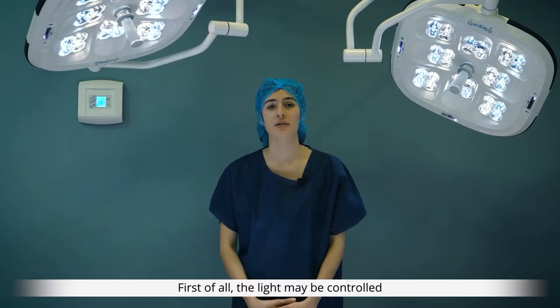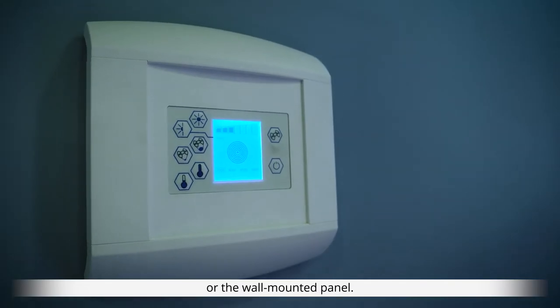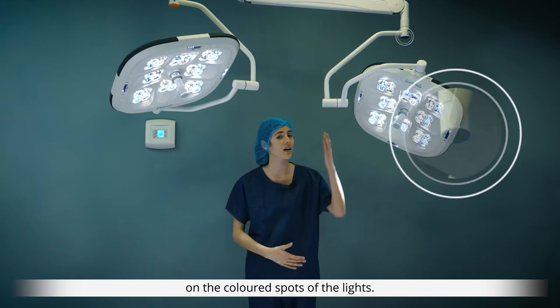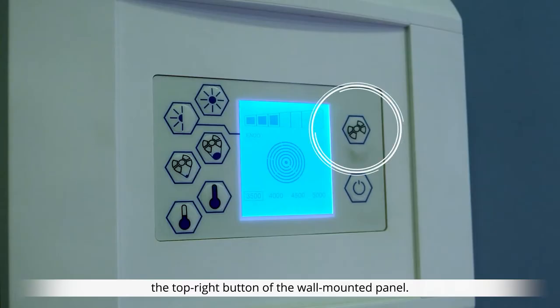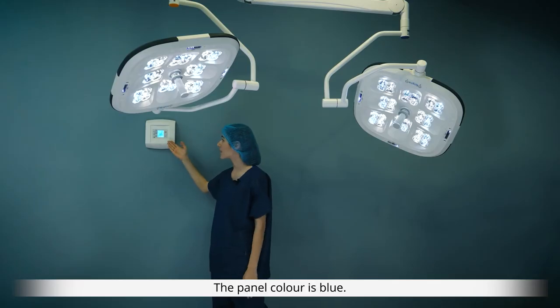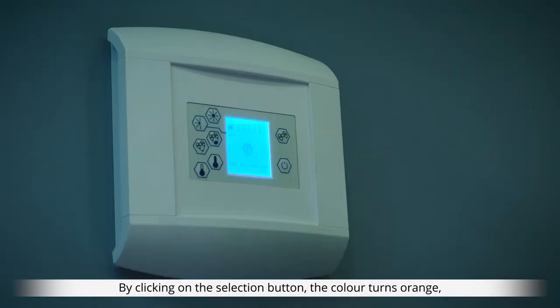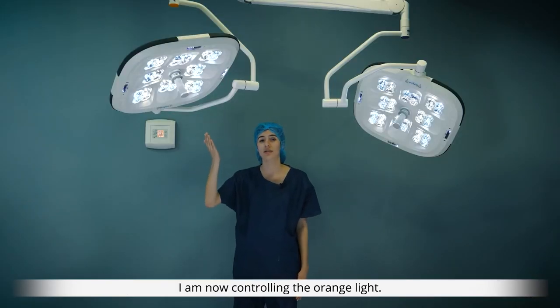The light may be controlled by directly using its contactless sensors or the wall mounted panel. Each light is identified by a color which can be found on the colored spots of the light. The light you wish to control may be chosen using the top right button of the wall mounted panel. The panel color is blue, meaning I am controlling the blue lighting. By clicking on the selection button the color turns orange — I am now controlling the orange lights.